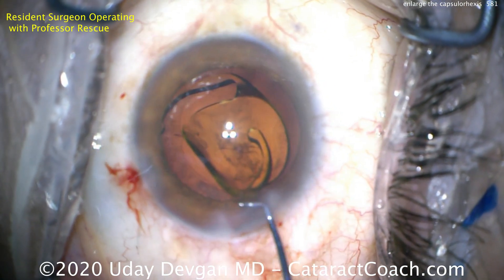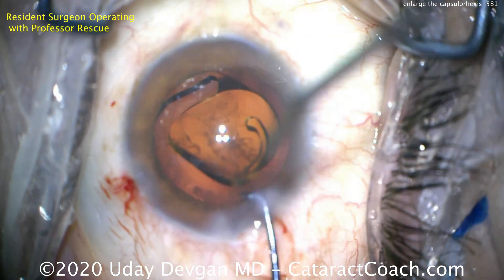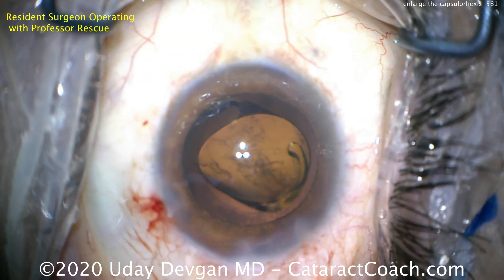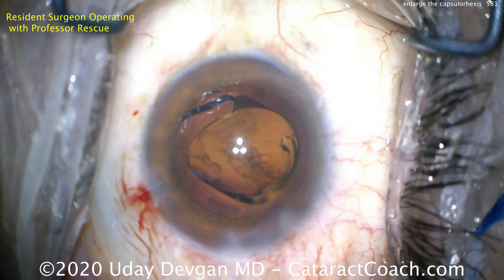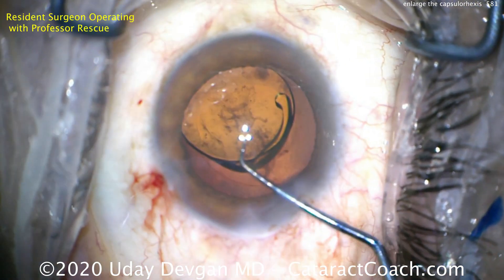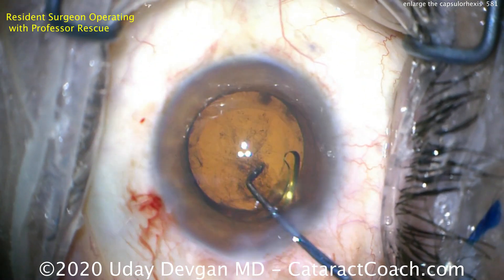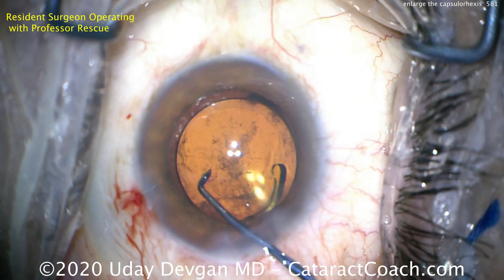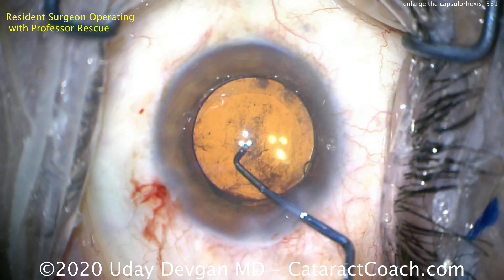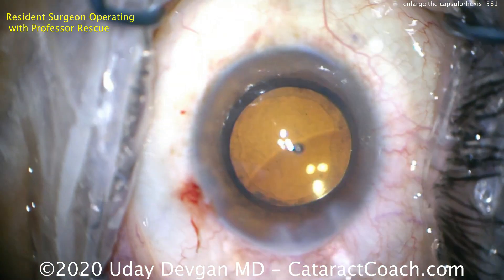This is a technique you can definitely use. Obviously the best solution is to make a good five millimeter capsulorrhexis right at the very beginning. But if you end up making a very small, irregular, or decentered capsulorrhexis, you can use this technique: use a sharp instrument — either Vannas scissors or a tiny blade — to nick the capsular edge tangential to the tear, then grab that little strip and tear off a crescent-shaped piece of anterior capsule to create a normal capsular opening.